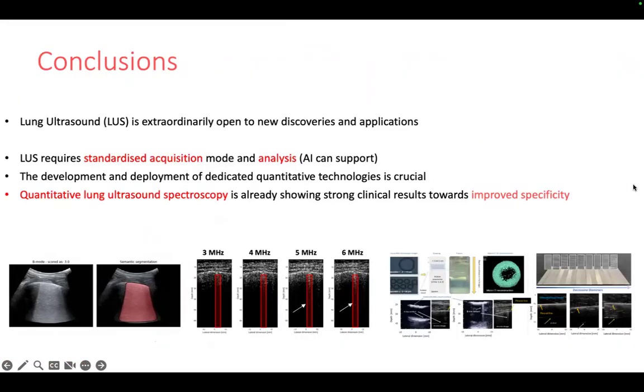So with this, I'd like to conclude by saying that lung ultrasound is an extraordinarily open field to new discoveries and applications. That for sure, lung ultrasound requires standardized acquisition modes and analysis, both for the use with clinical scanners as well as with these newly developed techniques. Artificial intelligence can support in standardizing the acquisition and the analysis.